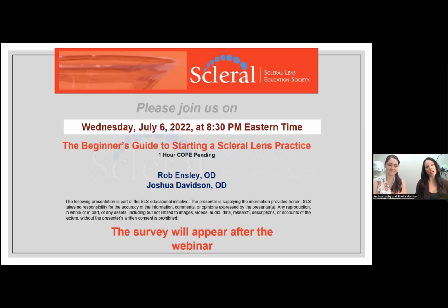Usually, my rule of thumb is that if there's any decreased vision with best vision with a hard lens, then we have that conversation about expectations, because they'll be a little bit more likely to lose even just a little bit of that clarity that they do have. So patients that are already visually compromised, I usually recommend that they wear glasses on top of their contacts.